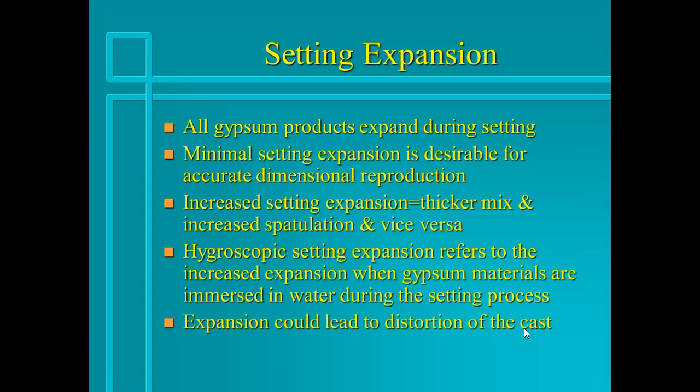Now let's discuss setting expansion. All gypsum products expand externally during setting, and plaster is a gypsum product that expands the most. Minimal setting expansion is desirable for accurate dimensional reproduction. Increased setting expansion is caused by a thicker mix and increased spatulation and vice versa.